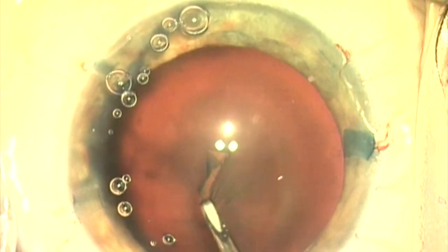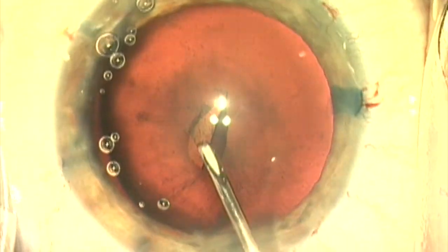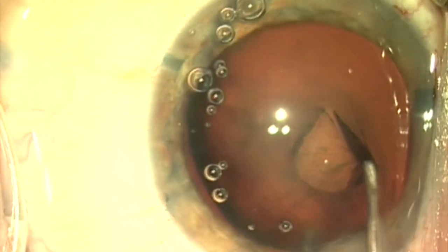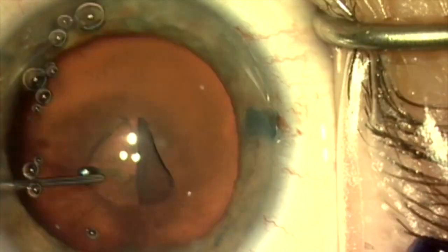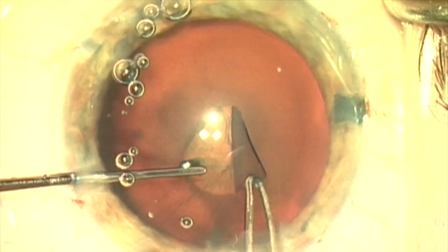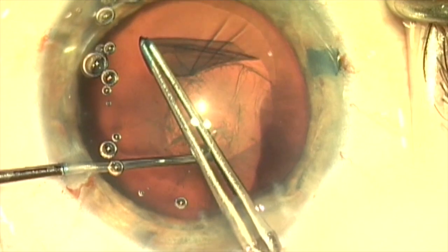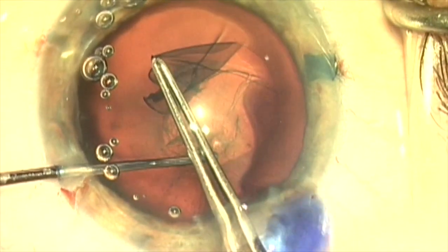We're going to start the capsulorrhexis with the cystotome, and there's no counter-traction here, so if I start pulling on this, the lens will start to move because the zonules are absent at 6 o'clock. So I'm going to introduce a Kugelin hook and use that in my left hand to provide counter-traction to stabilize the lens as I tear with my right hand, allowing a more controlled and safer capsulorrhexis.